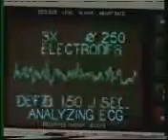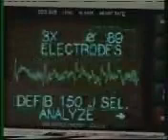You should be familiar with these other messages to avoid confusion and loss of time in a cardiac emergency. These are advisory messages the ZOLL PD 2000 will display in certain situations. Noisy ECG, retry analysis. This message is displayed when the ECG signal quality is too noisy for reliable analysis.